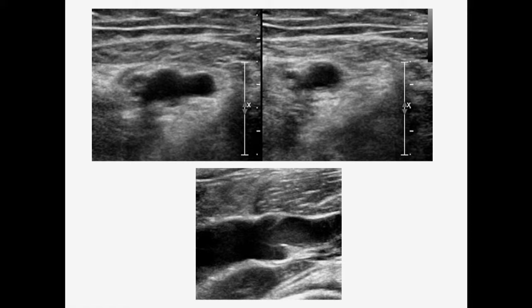The vein wall has a much less robust muscle layer and can compress easily compared to an artery. That's how we diagnose on 2D cross-section which one is the vein. It's very important to look for the venous valves, especially at the saphenofemoral junction and saphenopopliteal junction, while evaluating superficial veins.